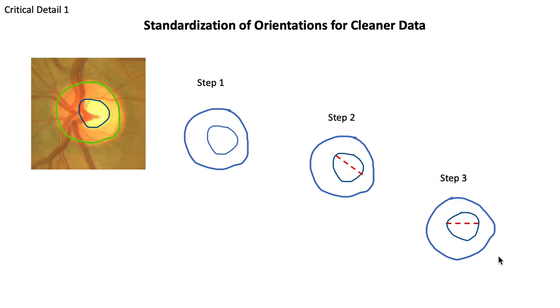We align our data in this way in order to get cleaner data. We do this because we find that nature is inherently polar, as in North Pole versus South Pole, anterior versus posterior, and so on and so forth. And when we align the data this way, we get much cleaner results.